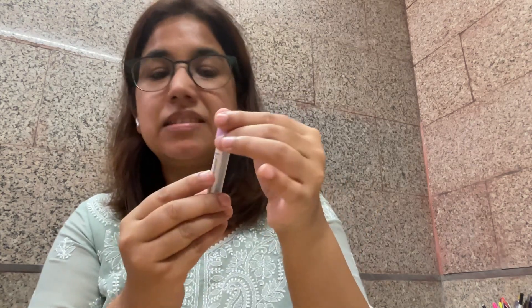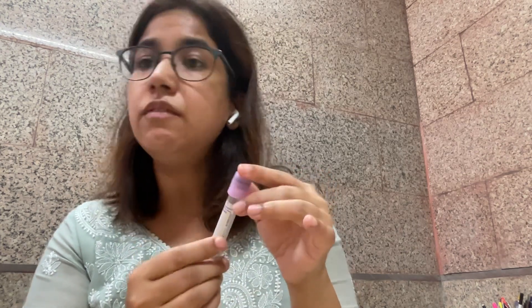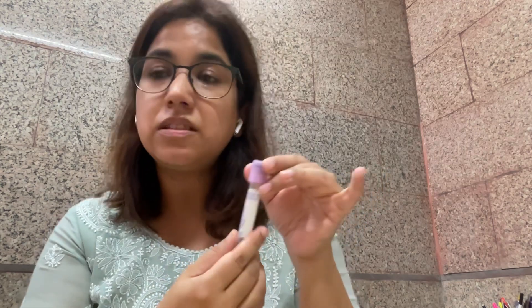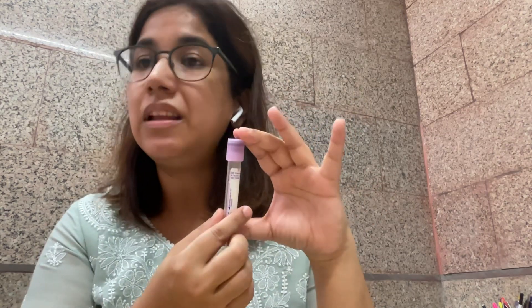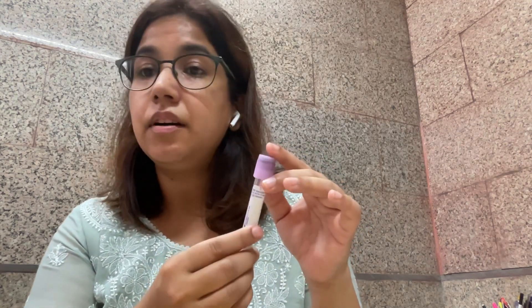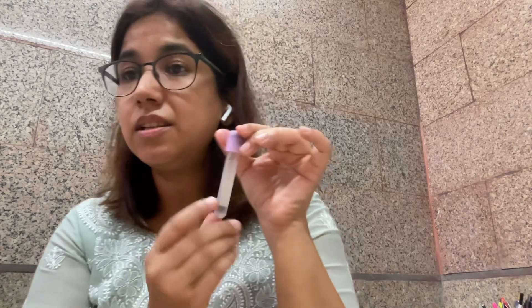The lavender top vial contains an anticoagulant, meaning it will not let the blood coagulate. The anticoagulant is mostly dipotassium or tripotassium salt of EDTA, which chelates calcium ions. Since calcium ions are required for coagulation, removing them prevents clotting. What we get from this vial is whole blood, which is used for hematological investigations such as CBC and glycated hemoglobin.